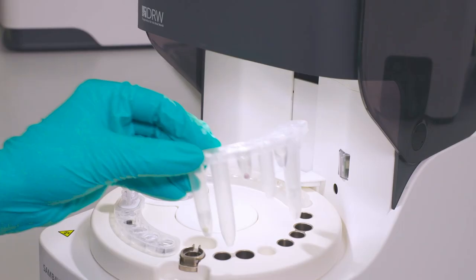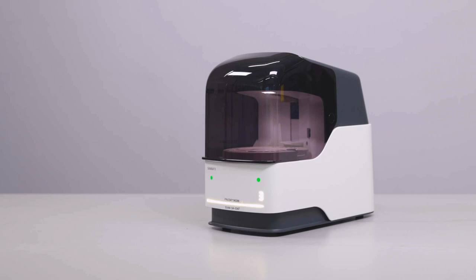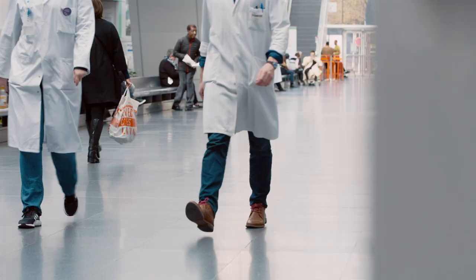All the testing is done in the device — there is no need to send the test to a centralized lab. After approximately 90 minutes, you have reliable results. It's a real point-of-care device.